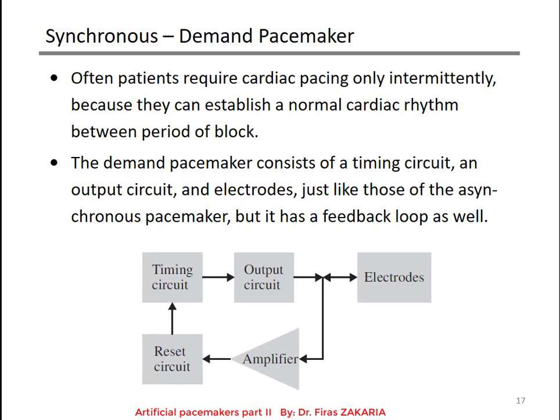However, if a heart block occurs, the pacemaker or this circuit takes over and stimulates the heart at the fixed rate of the timing circuit. This is how this demand pacemaker works.